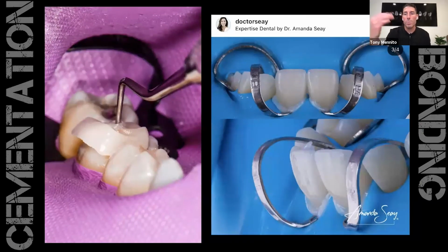This is just a picture, and I like to talk about the differences in nomenclature between cementation and bonding, and understanding that cementing something with an RMGI luting cement does really nothing to help support the restoration itself. All it does is provide some friction between your restoration and a retentive prep that you have created for the purposes of keeping that restoration on.